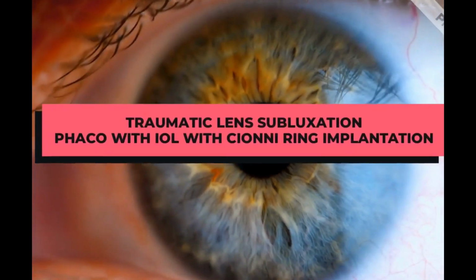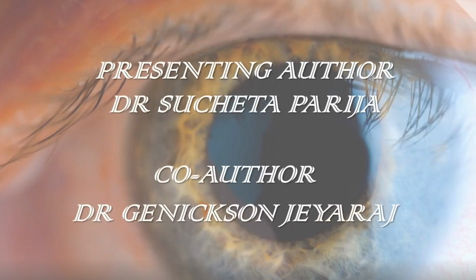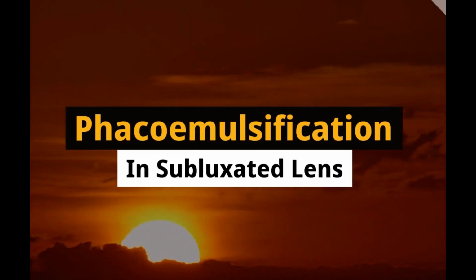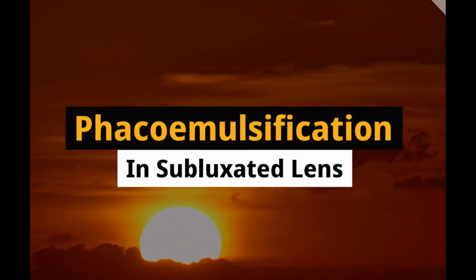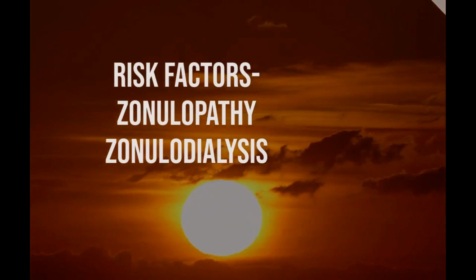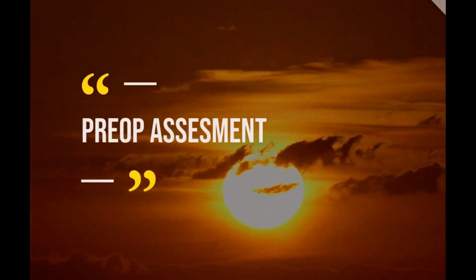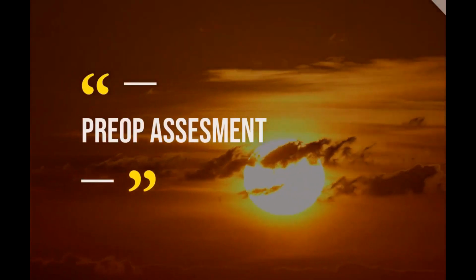Hello everyone. This video is about managing a case of traumatic lens subluxation. Performing phaco in a subluxated lens is extremely challenging, with the risk of potential complications at almost every step of surgery. The predisposing risk factors for subluxation include weak zonules or torn zonules.